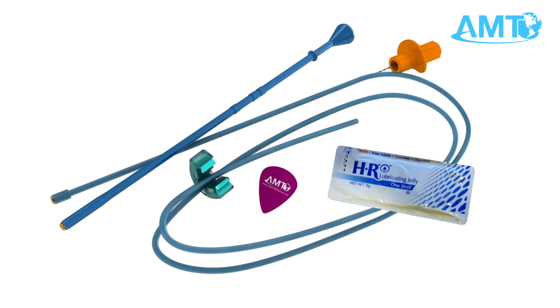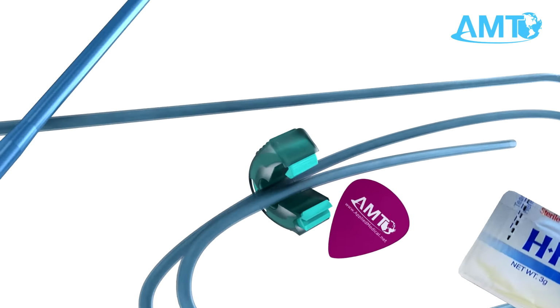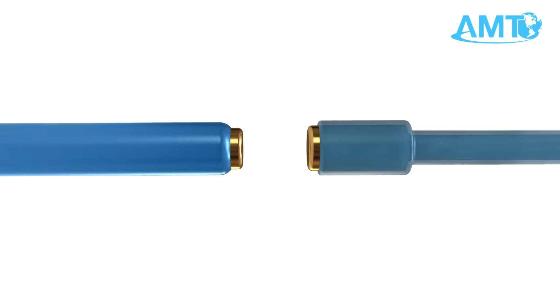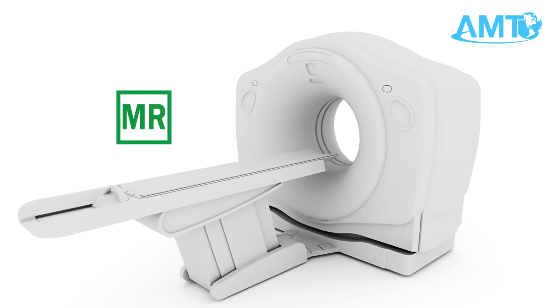The main portion of the kit, the probe and bridle catheter, have tiny but powerful magnets at their tips and are integral to making the connection between the two pieces. However, after proper placement, the AMT Bridle Pro is MR safe.